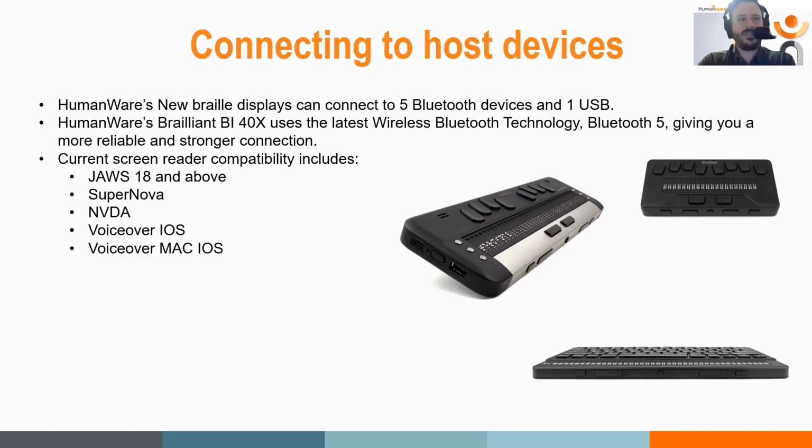What I'm going to do, everybody, is share my screen so you all hear my screen reader. I'm going to walk us through the steps of how we pair, as well as some basic commands with the JAWS screen reader. As a JAWS user for more than 25 years at this point, I go pretty far back. When I was a wee little lad, as Andy would say, I've used JAWS for a long time.